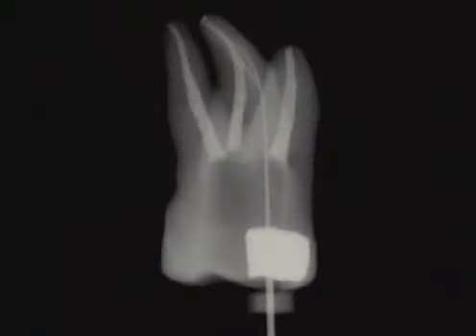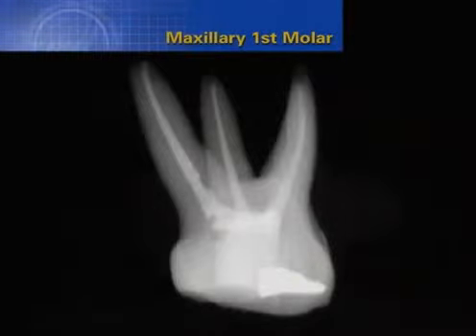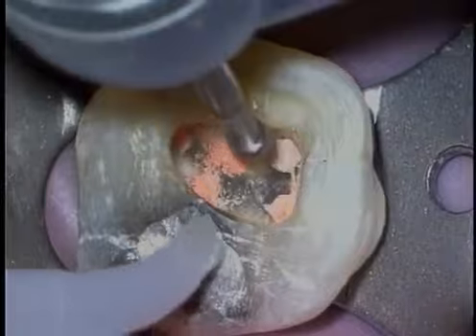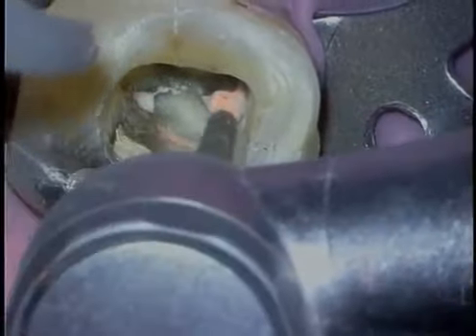In the mesial angle, it would appear the MB2 is contiguous with the MB1, but the distal angle shows that it's separate over length. In this lone view, this maxillary first molar appears to have 3 roots. Let's re-enter the tooth and check out the pulpal floor.